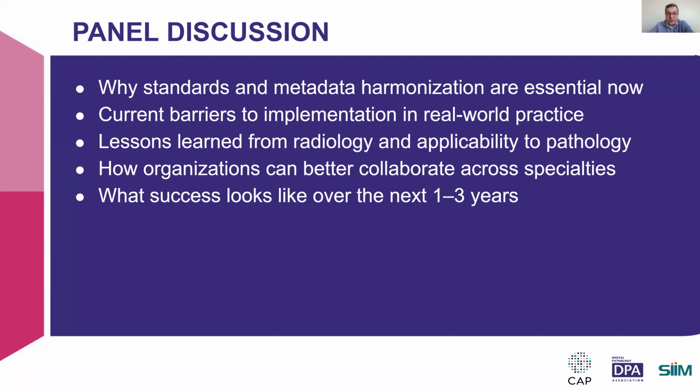We also need to make sure that all these DICOM tags or metadata fields critical for AI and patient care, for example specimen type, stain, and scanner, are covered, and also use standards like SNOMED and LOINC. Most importantly, we need a measurable increase in the DICOM Working Group Connectathon and the IHE Connectathon participation from the majority of pathology vendors.